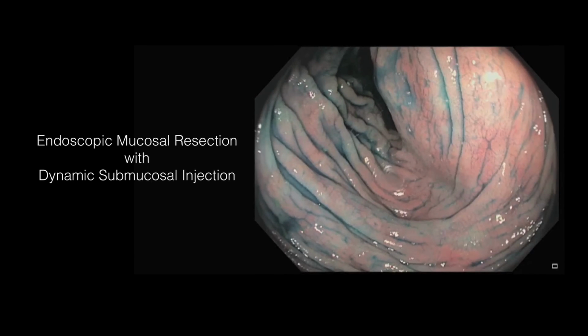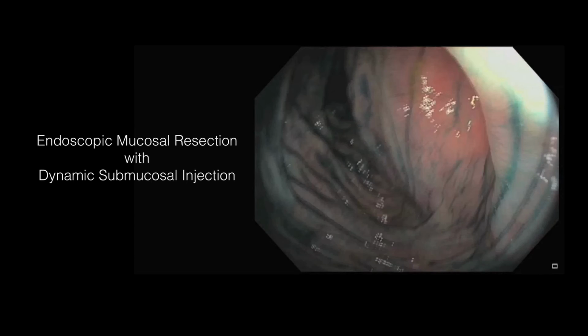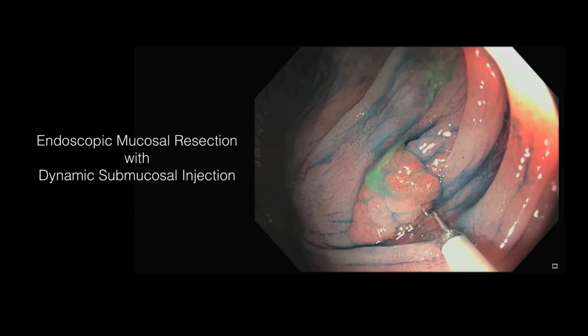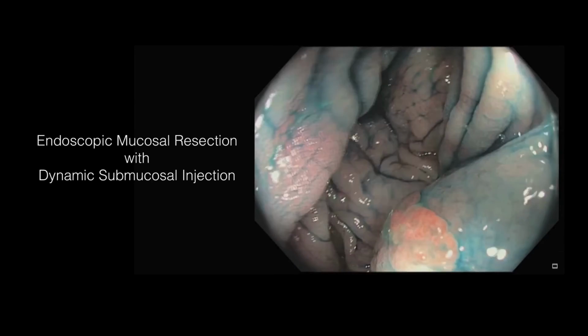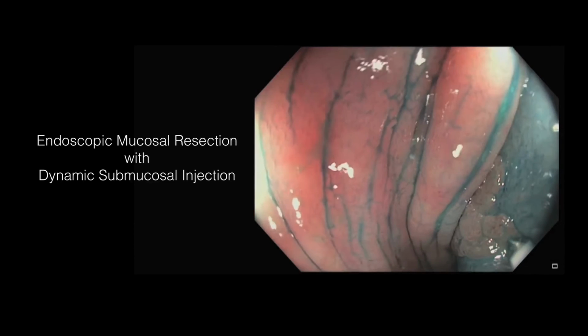During chromoendoscopy inspection, we identify a lesion that appears amenable to endoscopic resection. We proceed with endoscopic mucosal resection, first attempting to inject a mixture of diluted indigo carmine and saline into the submucosa to lift the lesion. Using the dynamic injection technique, we direct the injection into the lumen in order to mold the fluid bleb formation.